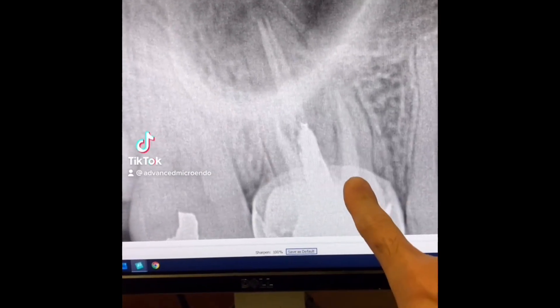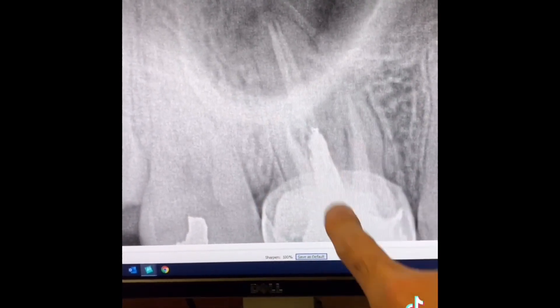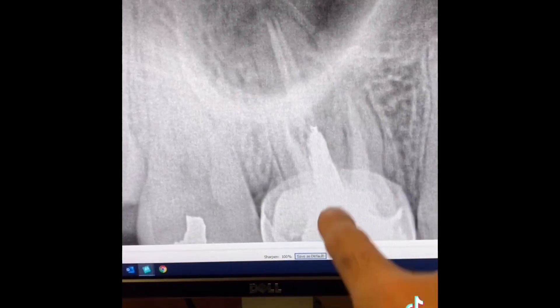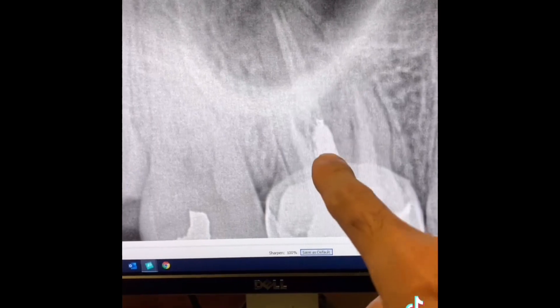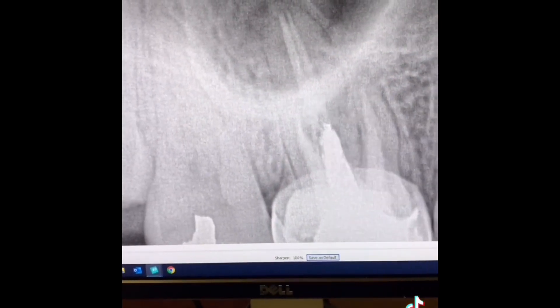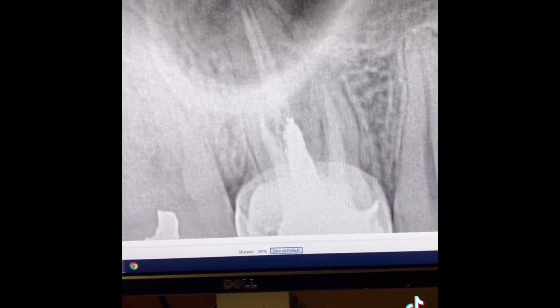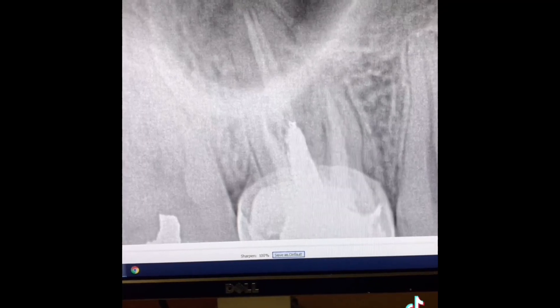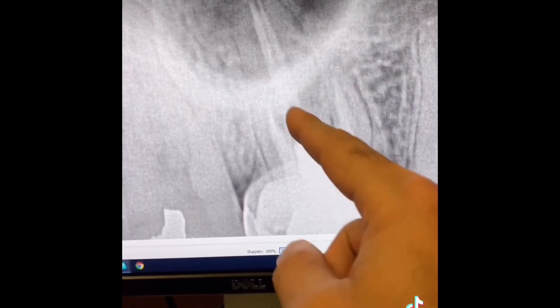Next treatment of the day was tooth number three. As you can see, there's a stainless steel crown on the tooth — huge post. You can see periapical radiolucency associated with the palatal root. It looks like two gutta-percha cones in there. So today we went ahead and completed the root canal retreatment in one appointment, going through the stainless steel crown and removing the post.